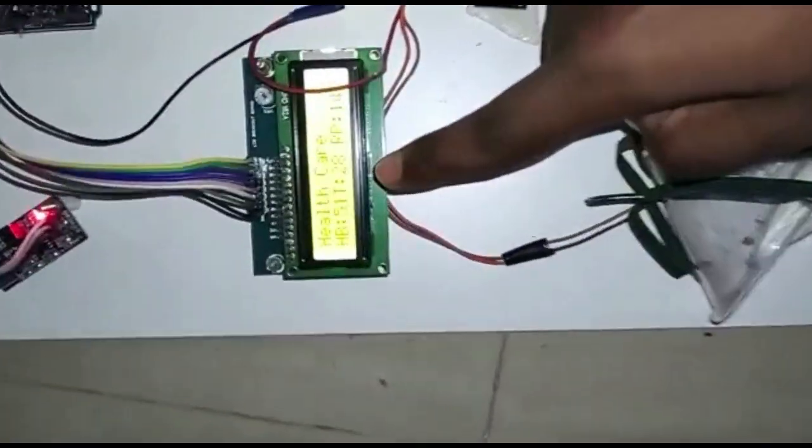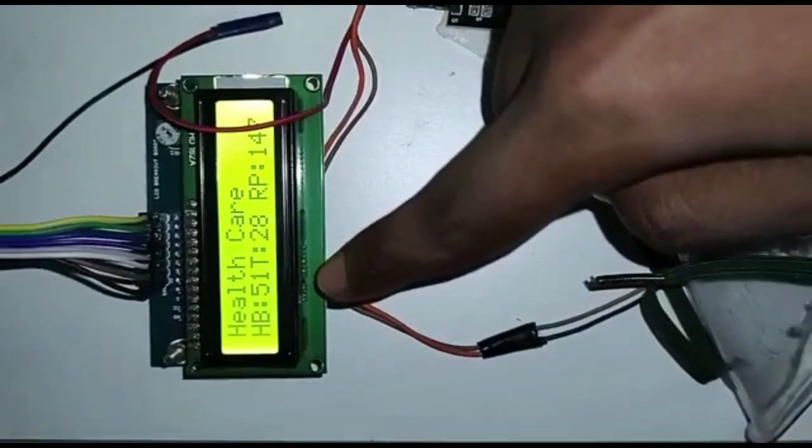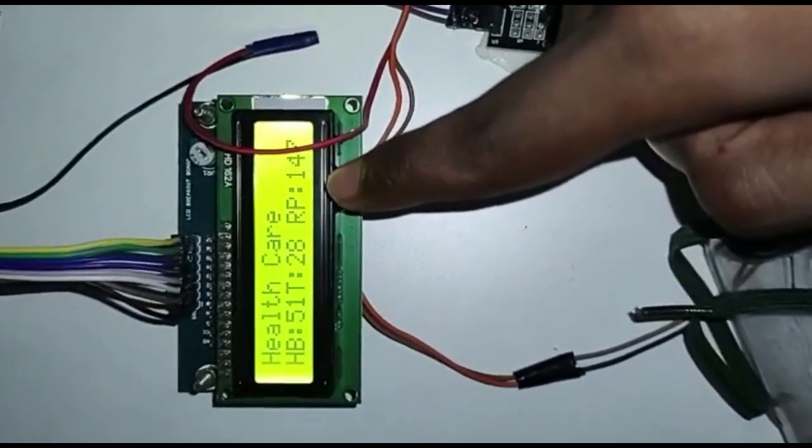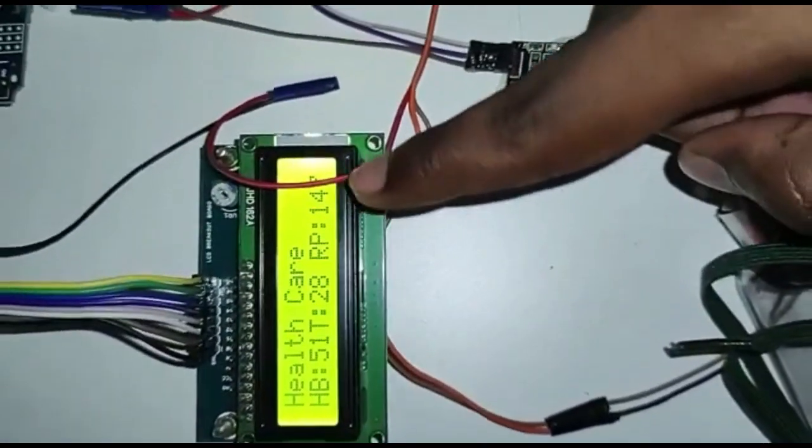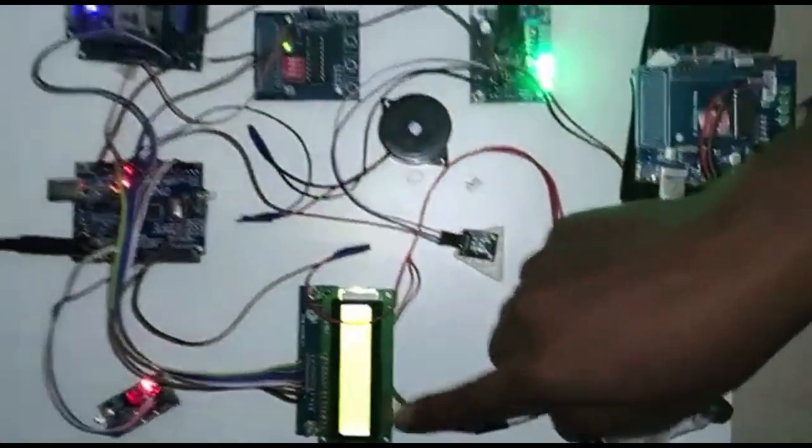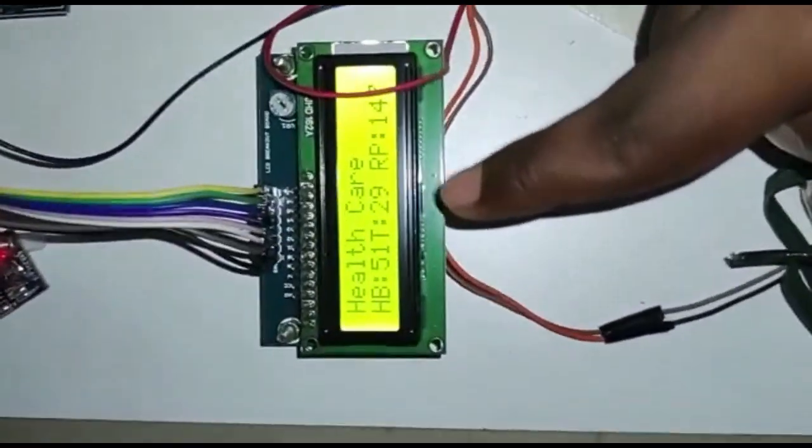This is an output display which will display the heartbeat value, temperature value, and respirator breathing value of the baby. When it exceeds the nominal value, it will trigger the alarm.